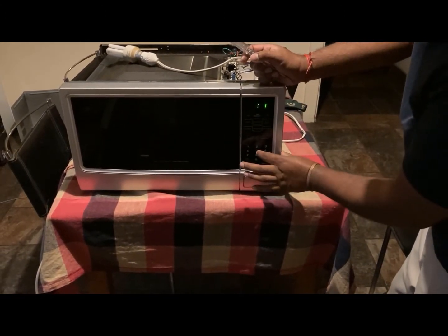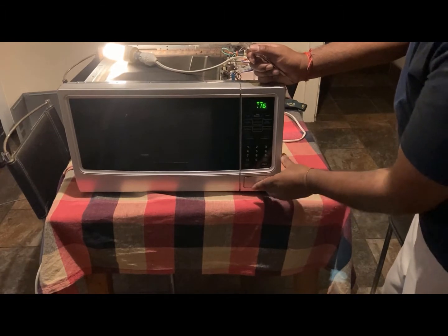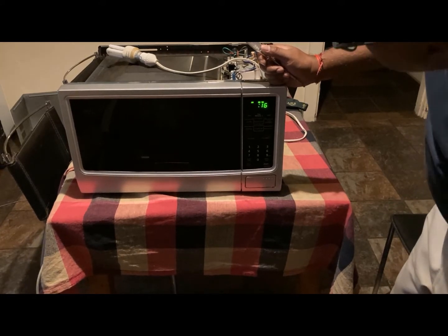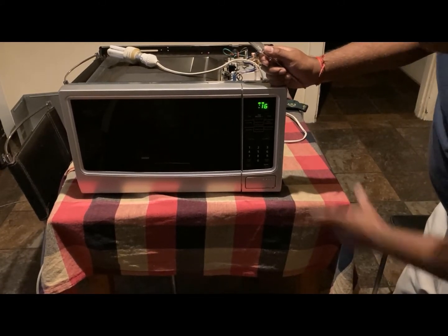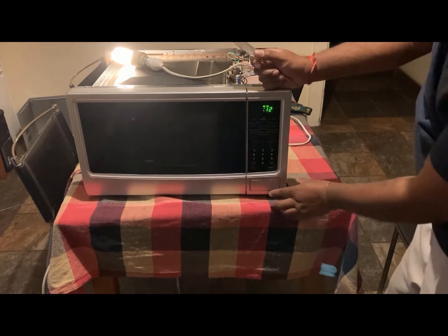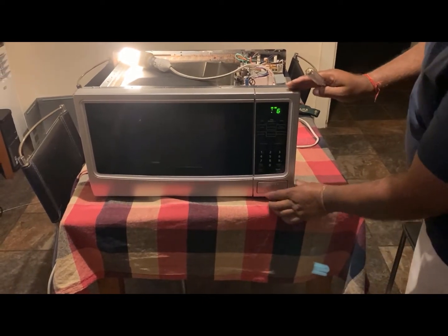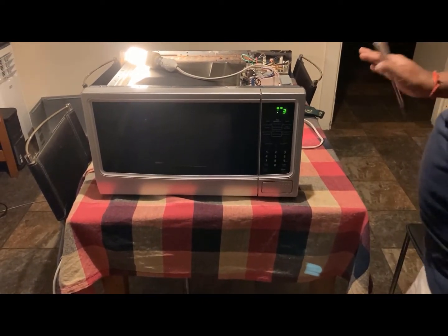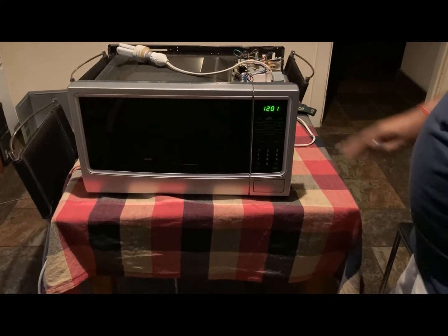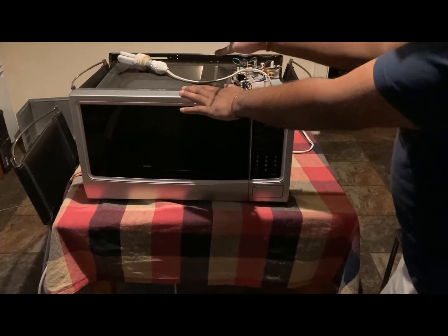So let's make it 18 seconds. We press start. Okay, so if I open the door, and if I put it back on, let's see. Need to press start. And this will tell you, listen, this thing is still on, please don't go touch. Plus it will make a noise. I'd rather have the fan on, on second thought, which is better. Okay, this will tell you that your item that is inside has been sanitized.